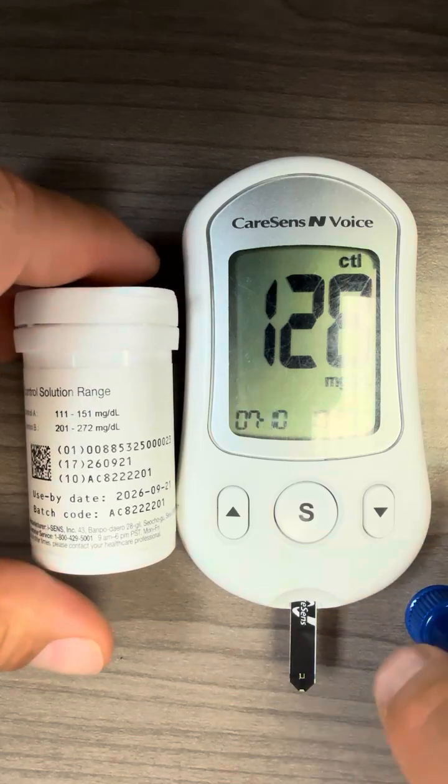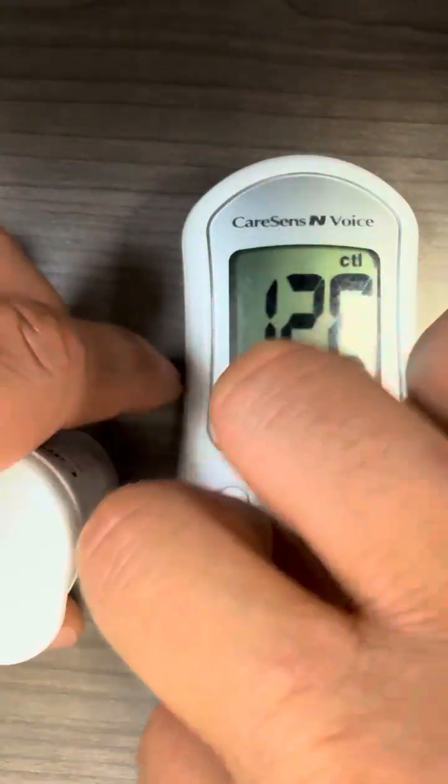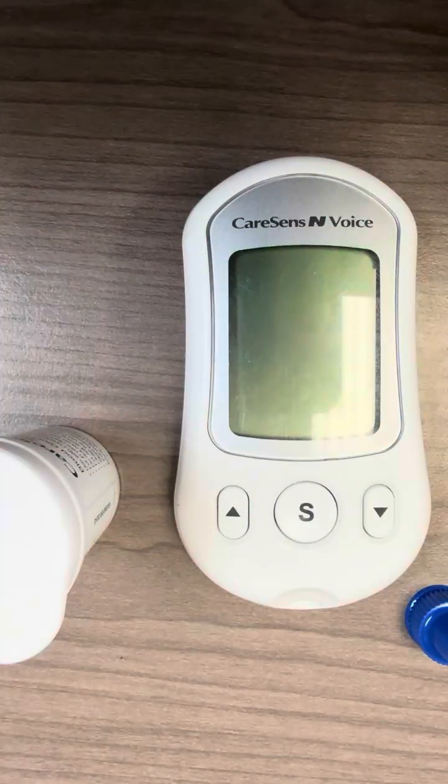From here, it's as simple as taking off the test strip to discard it, and it is good to go.